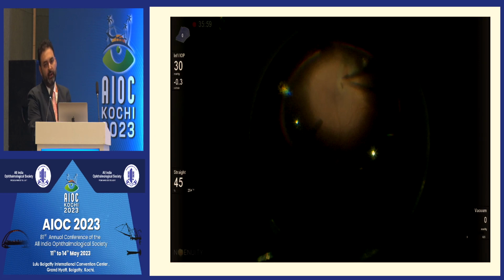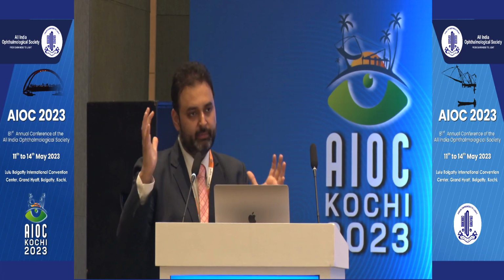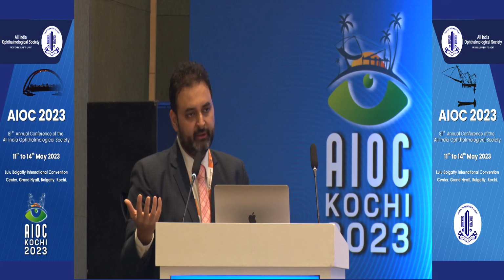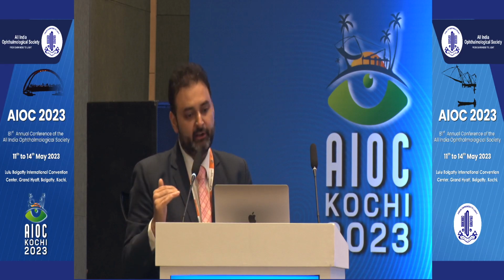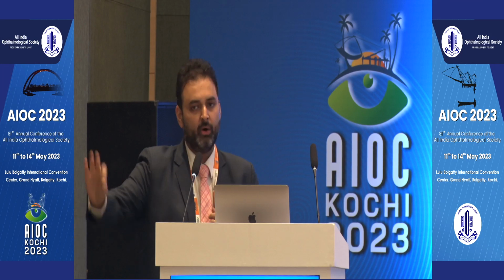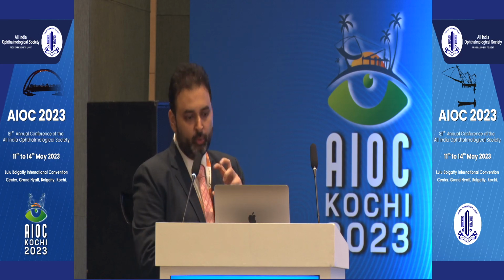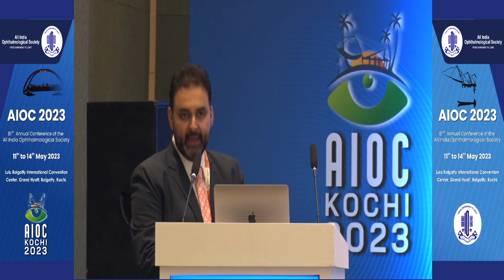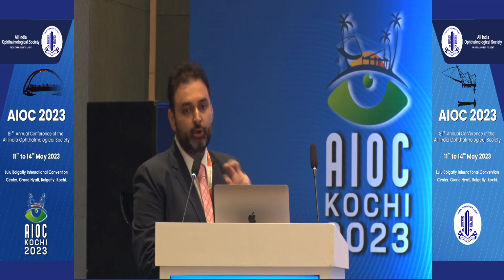So once you get oil under the retina, in contrast to PFCL, oil will very seldom be a small bubble or multiple small bubbles everywhere, because of the property of the oil. It'll actually stick together, so it'll be a large bubble, and depending on how much traction you have, you can get a lot of oil. The general dictum people follow is oil under the retina equals retinectomy always. I think Dr. Raman just showed not in every case. Depending on where your break is and how much traction there is, you can get away without doing a retinectomy, even with oil under the retina.